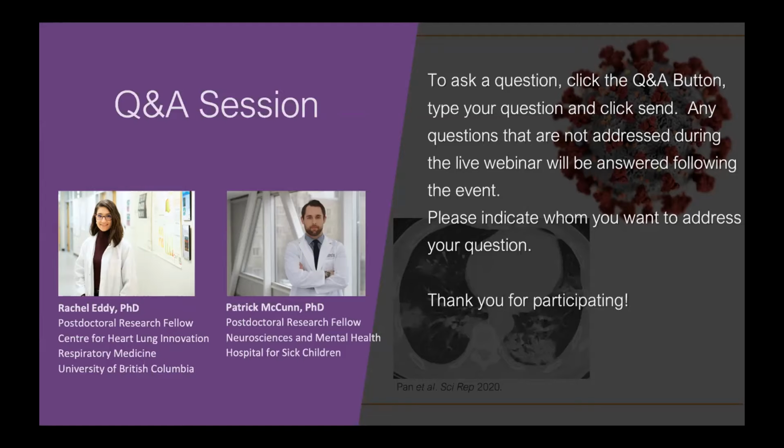And then when you're talking about integrating them with PET, the good thing about the systems we've discussed here, say something like the Aspect and the SimPET, it is designed with that end user in mind, where the software has possibilities. So you're looking at registration between images, which is really important. Attenuation correction. Both of these systems have their own attenuation correction built in. So obviously MR is MR-based attenuation correction, and CT is CT-based. So they do have those quality controls built in.